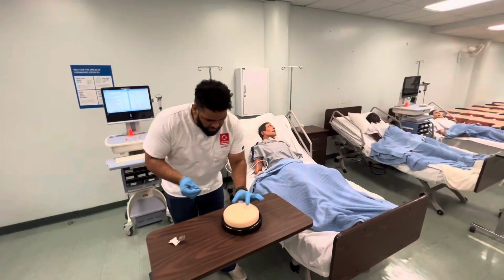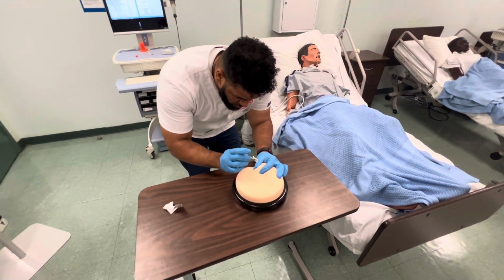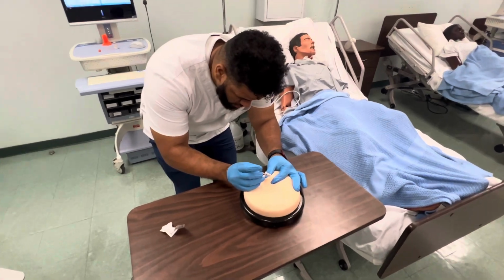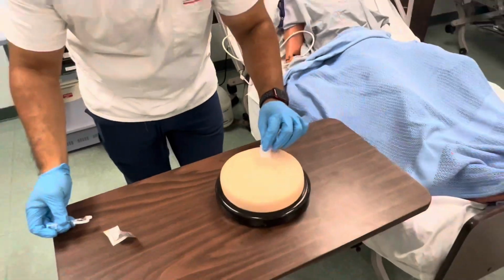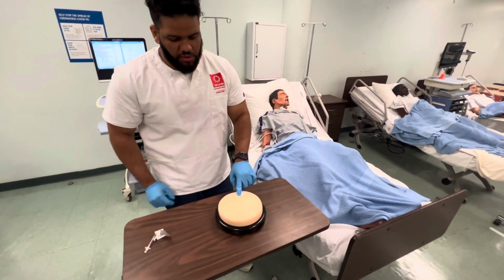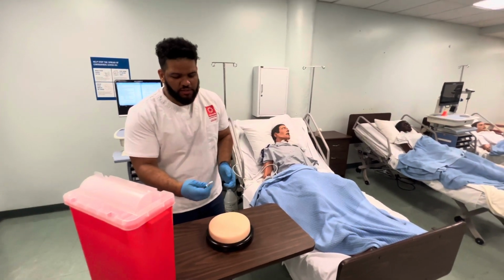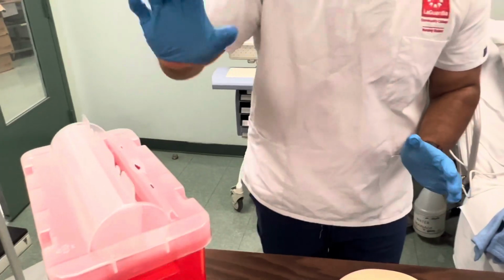So we're gonna grab and pinch at a 45 degree angle. You're gonna go in, squeeze, and then come out and grab the alcohol prep pad. So again, like so. Grab the alcohol prep pad. Do not massage, just gentle pressure on there for a few seconds. All right, so after we give the injection, we're going to activate the safety on the needle. And then from here, we can throw it away in the shark, okay?